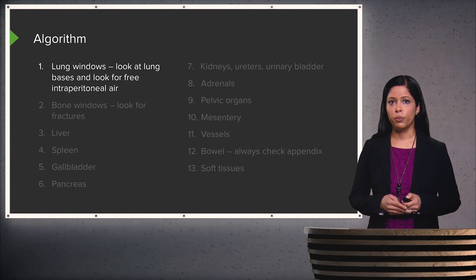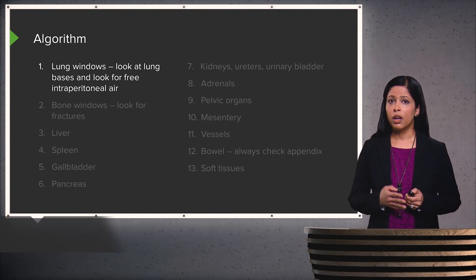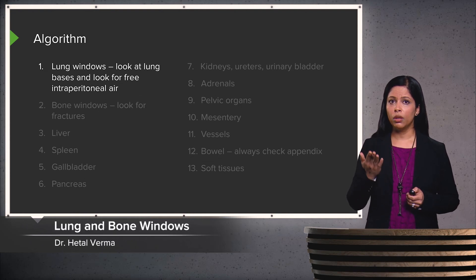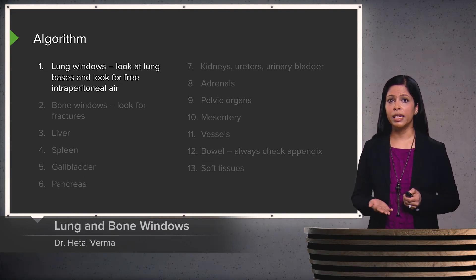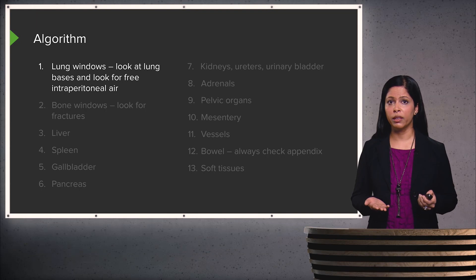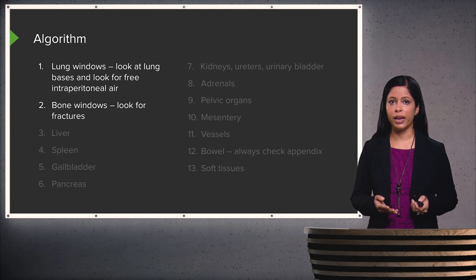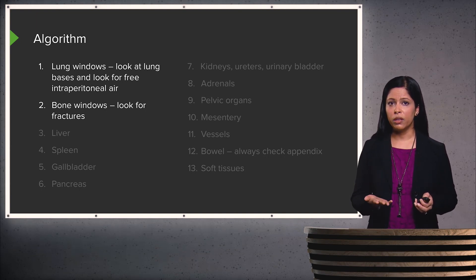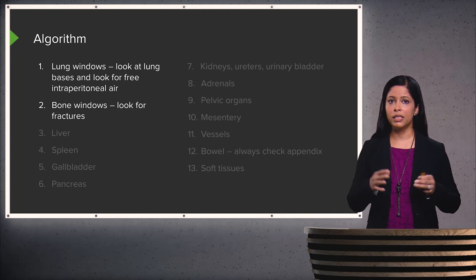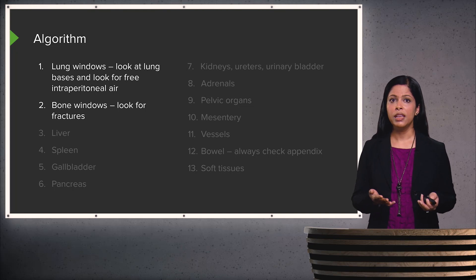Let's come up with a standard approach. I start off by taking a look at the lung windows — I look at the lung bases and then scroll all the way through the abdomen and pelvis, looking for any free or abnormal collections of air. I then look through the bone windows for any occult fracture. It's important in radiology that when someone comes in with a clinical finding, you don't focus only on that one finding — you take a look at the entire scan, including incidental findings.